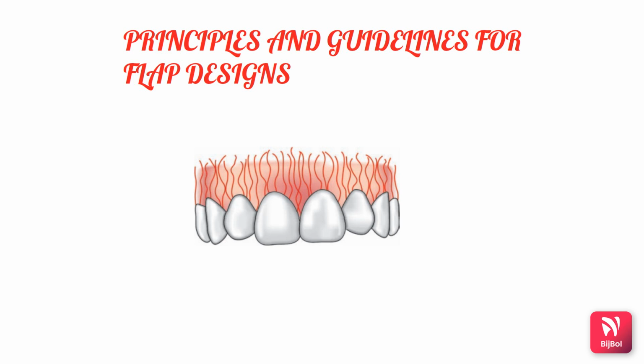Also avoid incisions over the radicular eminences. The incision should be placed such that the flap is repositioned over solid bone. The base of the flap should be wider than the free margin to preserve an adequate blood supply. Incisions should never be placed over areas of periodontal bone loss or periradicular lesions. The extent of the vertical incision should be sufficient to allow the tissue retraction to seat on solid bone, thereby leaving the root apex well exposed.